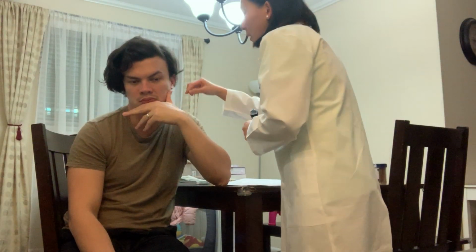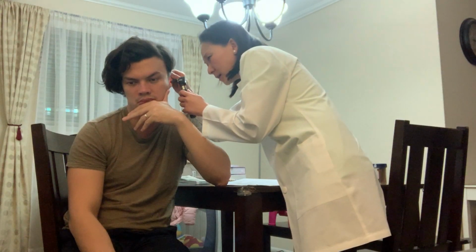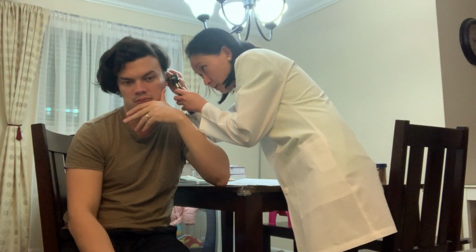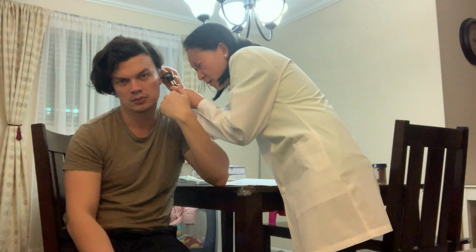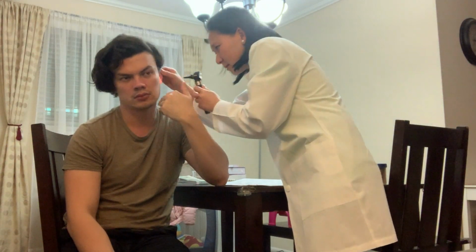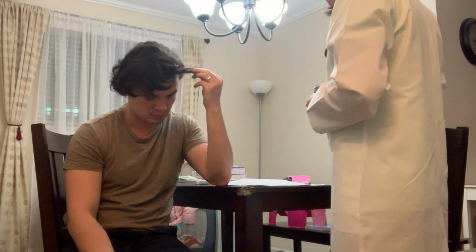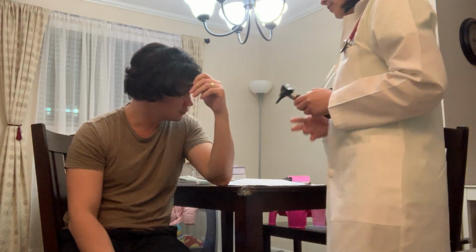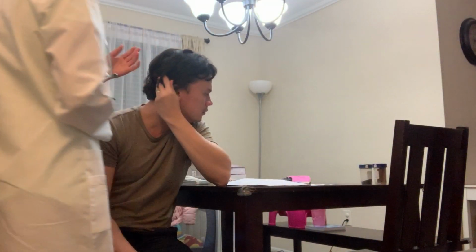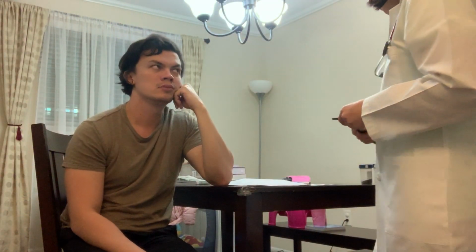For adult patients, we would pull up and back, and then visualize, making sure, okay, looks clean, and also visualize the tympanic membrane. We would do the same thing on the other side. Now for children, we would usually pull down and back.